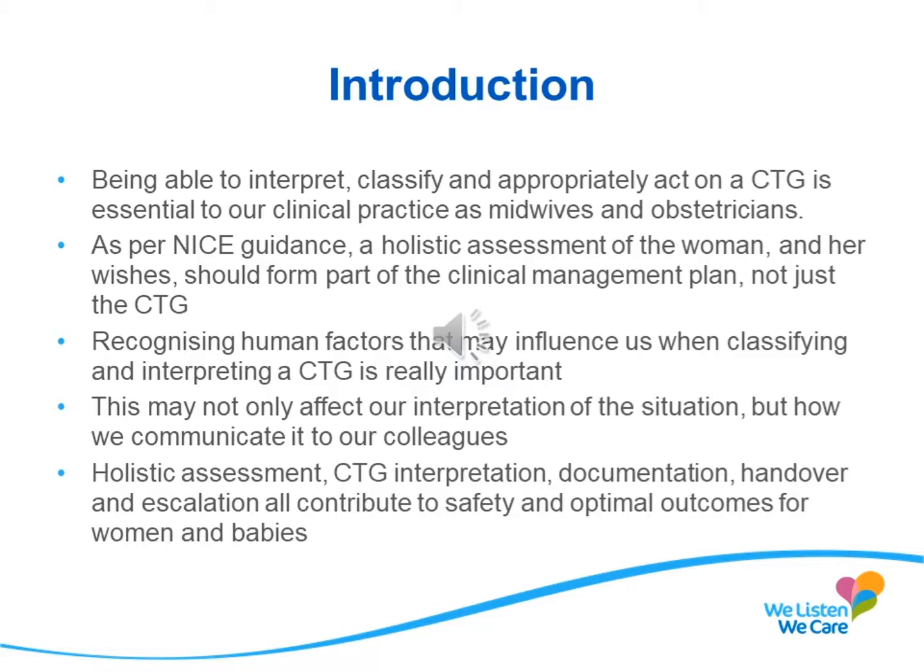Recognising how other factors might influence us when we classify and interpret a CTG is really important, because it not only influences our own actions, but that of our colleagues. Attention to all of these elements is really important for optimising the safety and outcomes for our women and babies in our care.